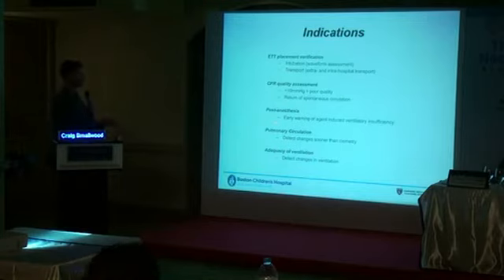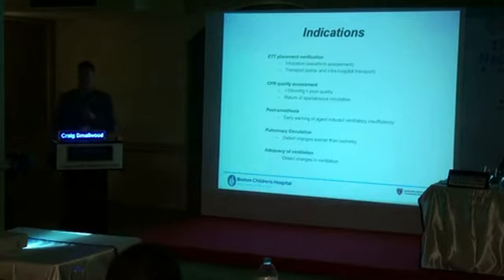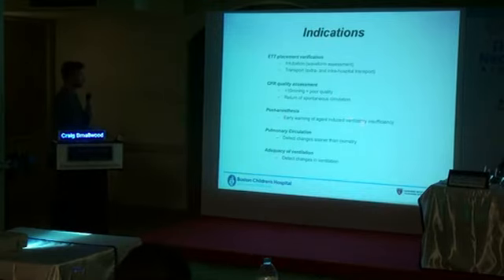But what they'll do in this case is to ensure that the patient doesn't have a hypoventilation event and therefore a hypercapnic event as a result of their sedation or anesthesia plan. It can be an early warning sign and much earlier than oxygenation. So you'll see a lot of indications like that. Pulmonary circulation, it can detect changes sooner than oximetry, not even VCO2.